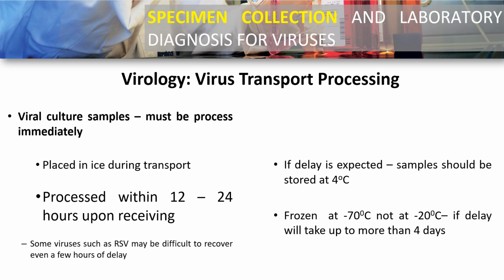First, for the transport, dapat naka-place siya in ice during the transport. Importante, class, hindi pwedeng by hand. So, dapat siya, ice box talaga siya. And then process within 12 to 24 hours upon receiving. Some viruses such as your respiratory syncytial virus, class, RSV, may be difficult to recover even with a few hours of delay. Kaya take note with this one.